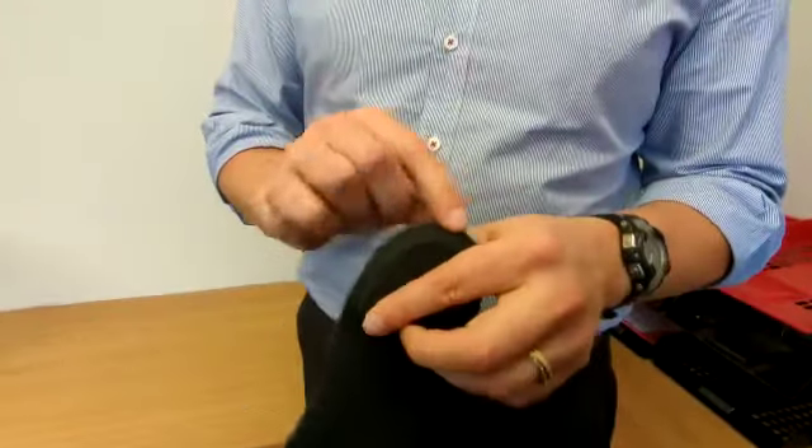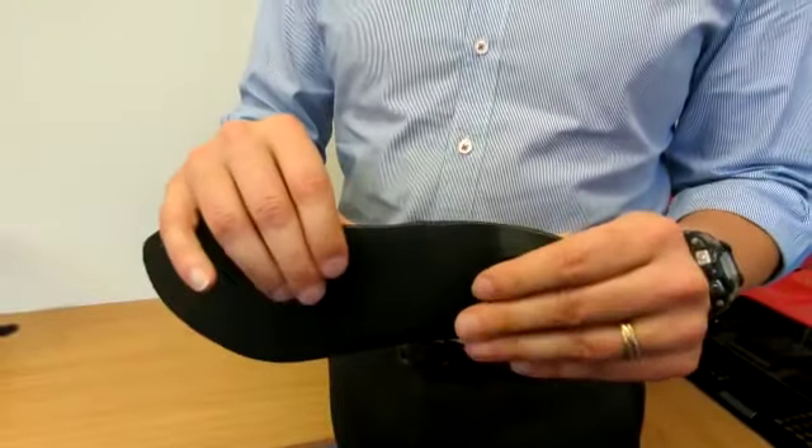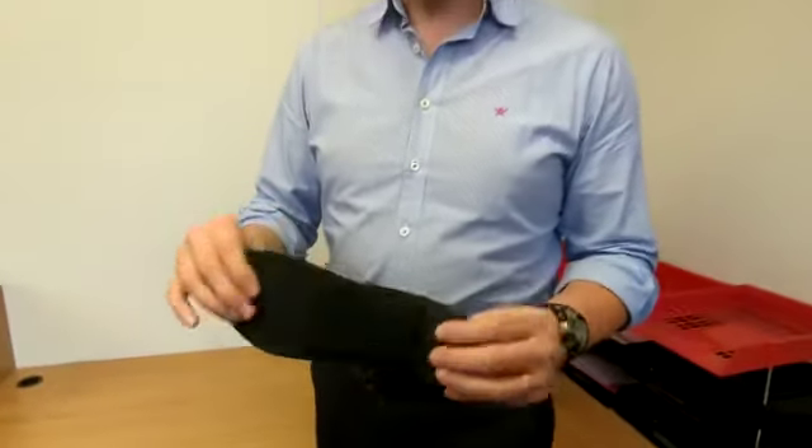It's worth having a look around the shell line to make sure there's no cracking or splintering there. But otherwise, hopefully your device is not displaying those signs. If it does, give us a call on 01603 327999 and we'll see if we can get that sorted for you.